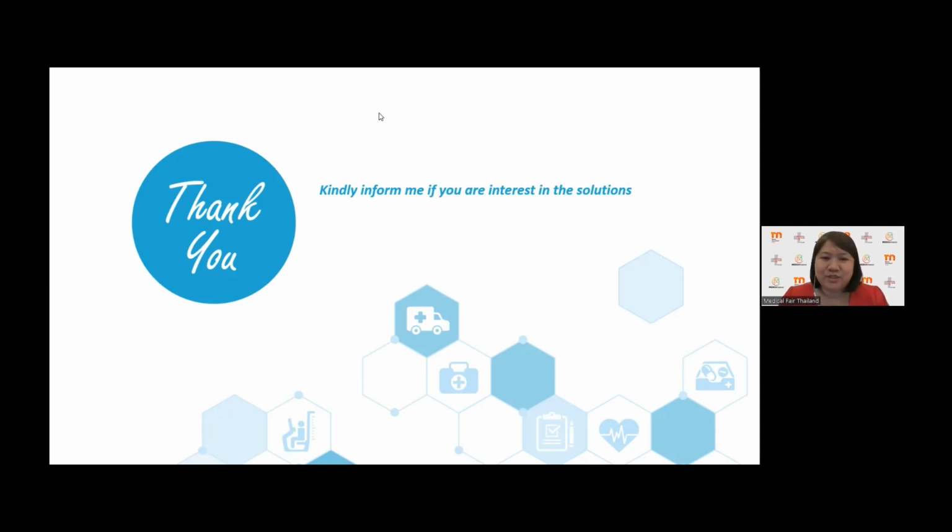Okay, and the next question, can you share with the audience how the blood sugar or uric acid levels are collected in your sensor, the non-invasive type? Actually, even the non-invasive type still needs to prick and get some blood. So our benefit is not from the blood taking. Actually, our benefit is from the data transmission. As I introduced, it still needs blood to test.